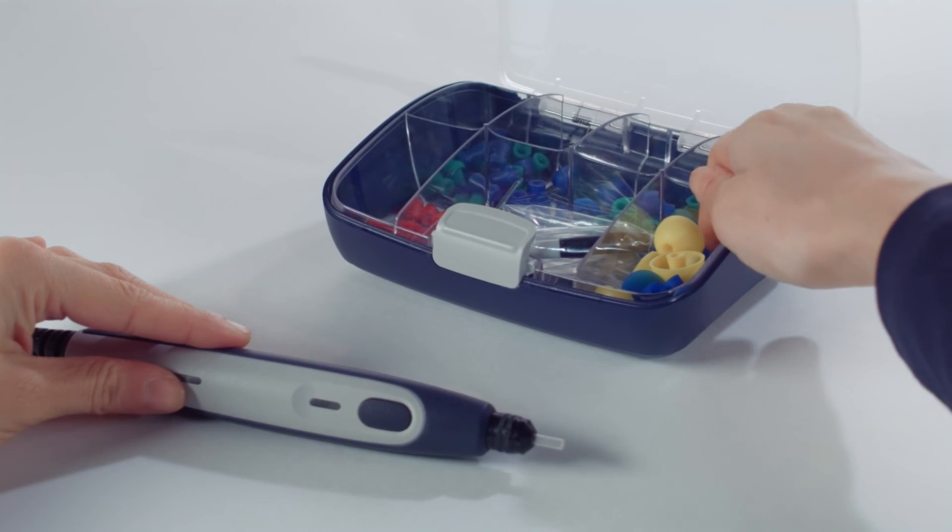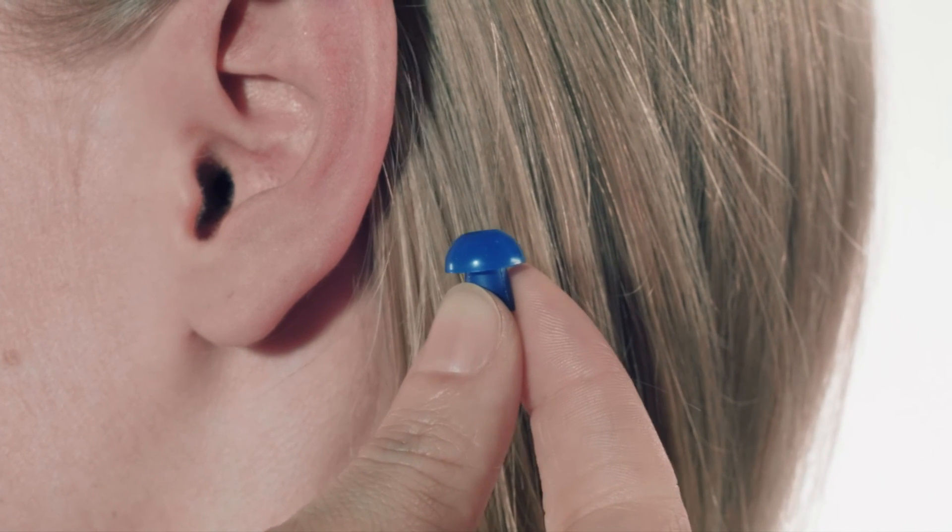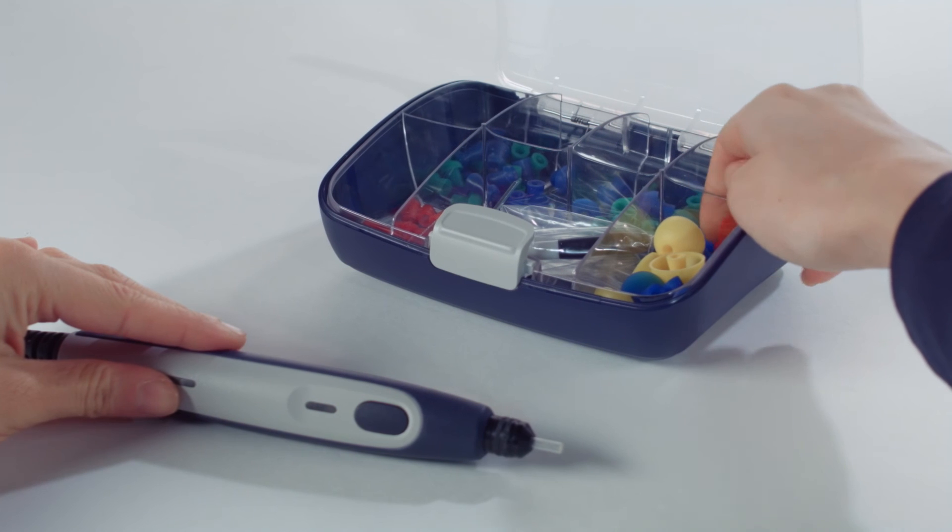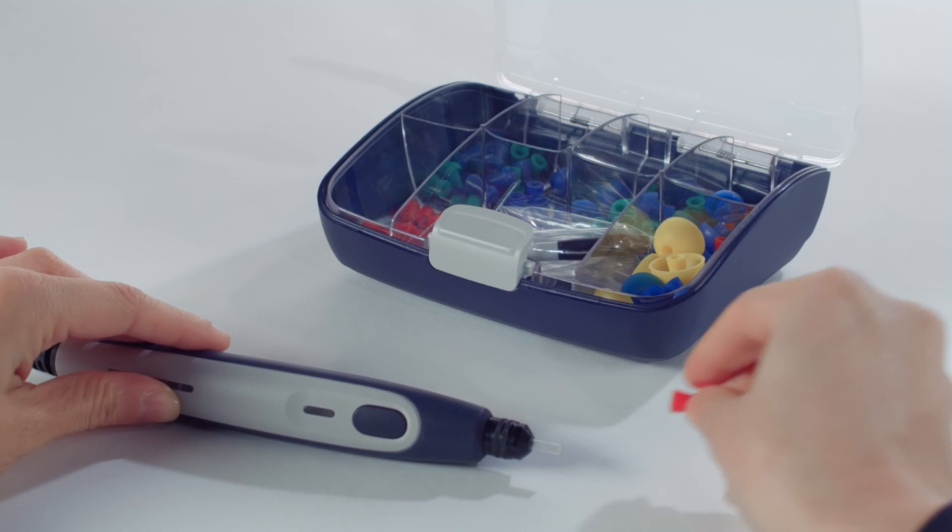To select the appropriate size of the ear tip, gently pull the ear up and back to straighten the ear canal. The ear tip should cover the entire ear canal opening but not be too big or too small.